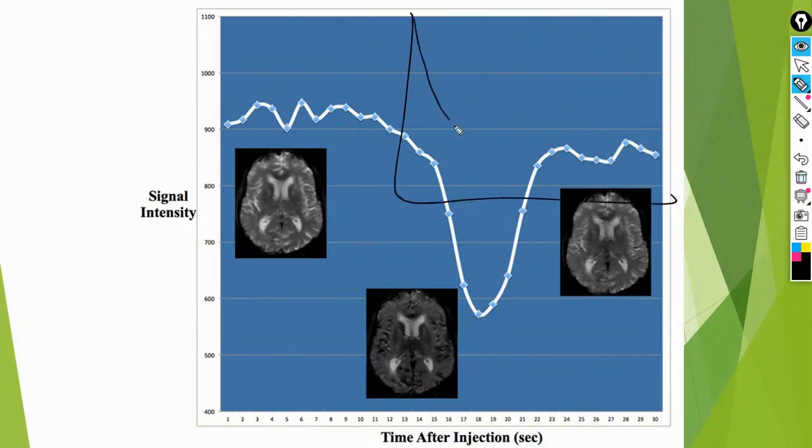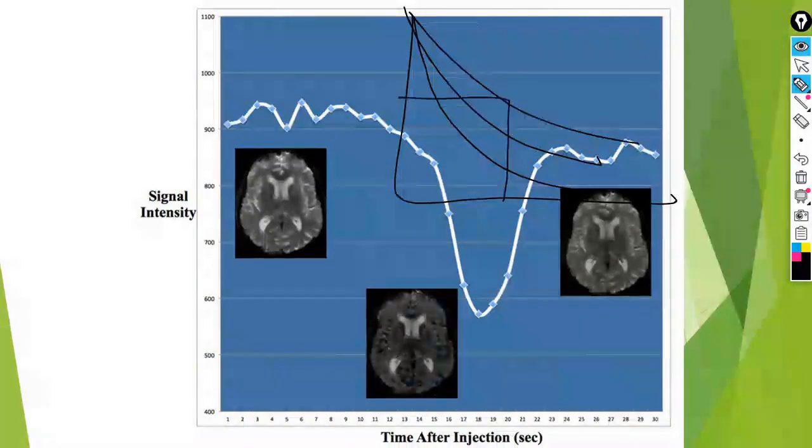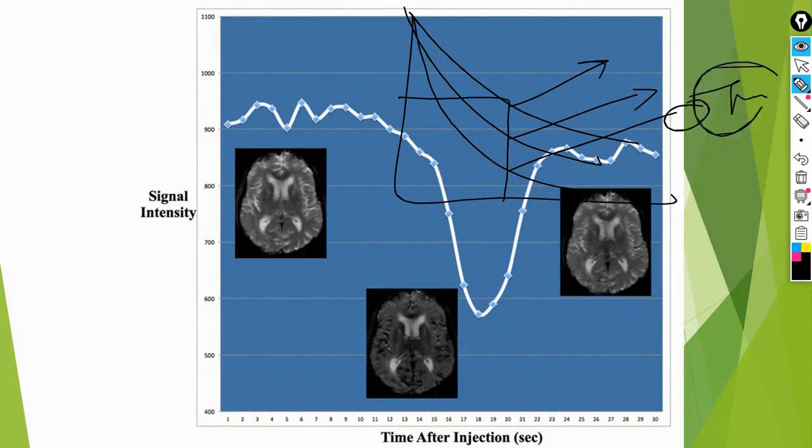Look here, this is a tumor. And here are the other tissues. I want to measure here at this time. Is this value high or low? Lower. So it's lower for the tumor. The tumor will have a weak signal for me.